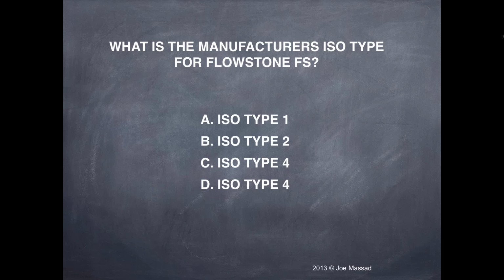I really believe that I go to labs where there's zero boxing. If you need anything, even a partial, you don't even know where the peripheral is because it hasn't been boxed, the model's been cut. So that's very difficult.